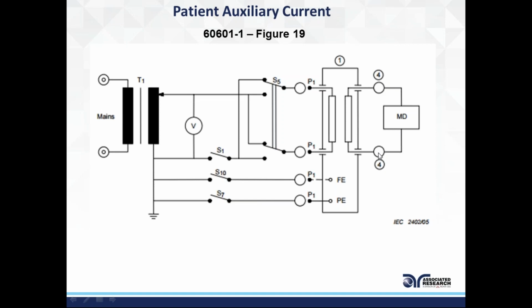So I'm measuring now if, with the two EKG leads that are connected to me, one EKG lead is going to cause current to flow between those 2 points to the other EKG lead. If I don't run these tests, I would never know what kind of leakage current a human may feel when they're coming in contact with the product you're designing. So again, you're going to power up your product normally. You have all your switches here, open ground, closed ground, those are all fault conditions, but your measuring device is now between applied parts. So this is what we call a patient auxiliary leakage current test, and this is measured between two applied parts.